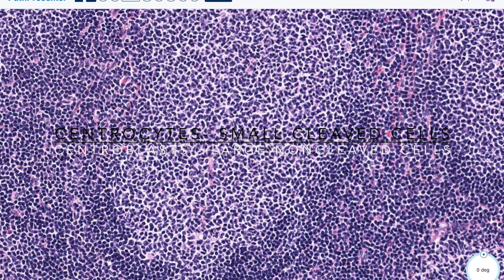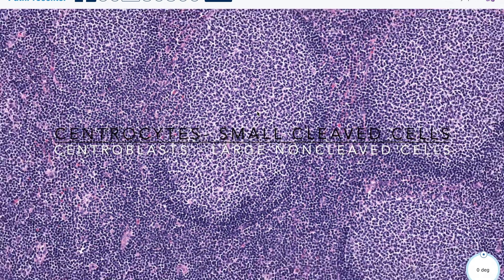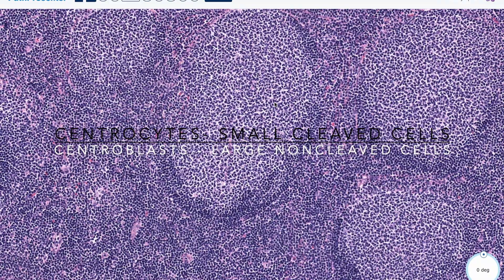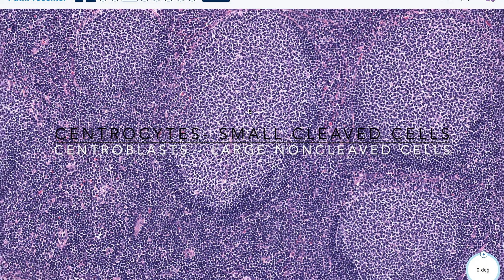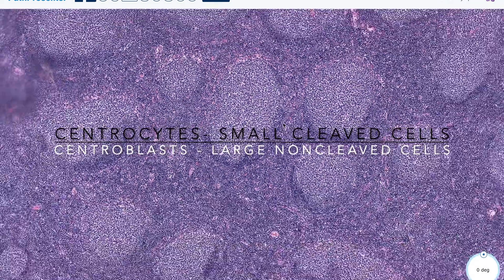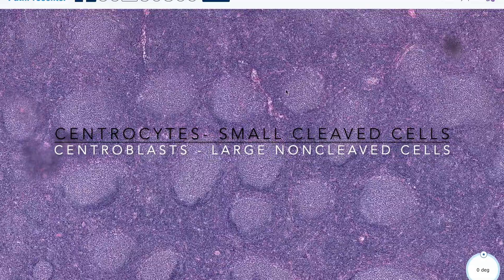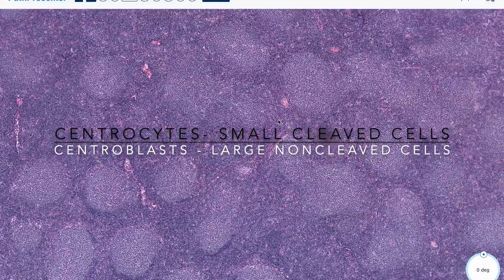So you have centrocytes that are smaller, more cleaved cells, and then centroblasts, which are larger, non-cleaved, and have nucleoli. It's important to learn how to differentiate centrocytes and centroblasts because that's actually how we grade follicular lymphoma.